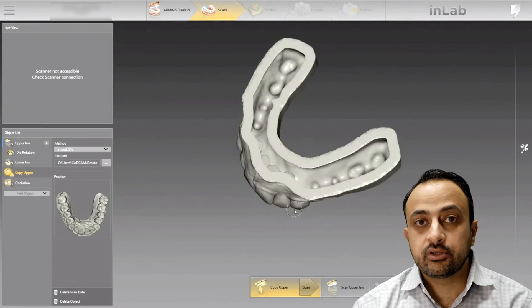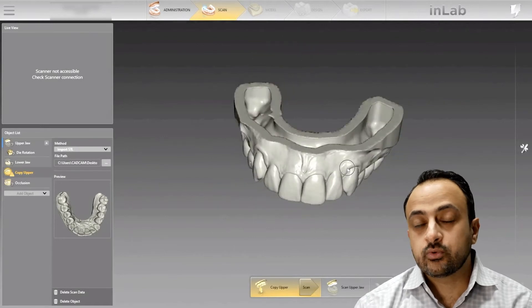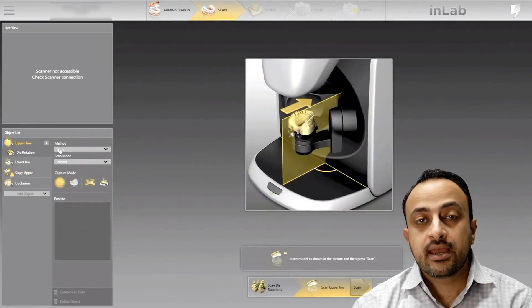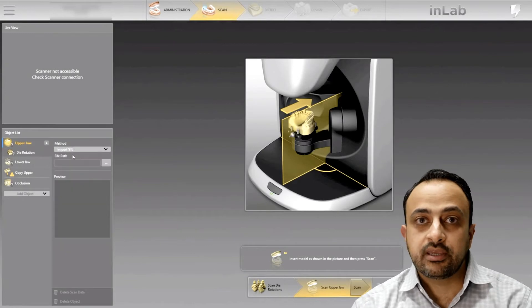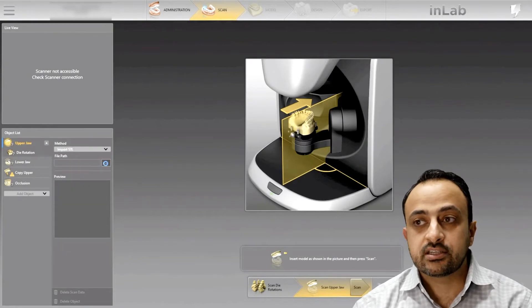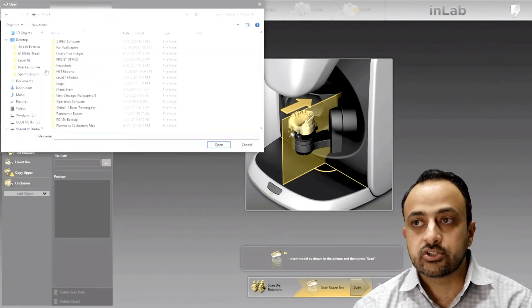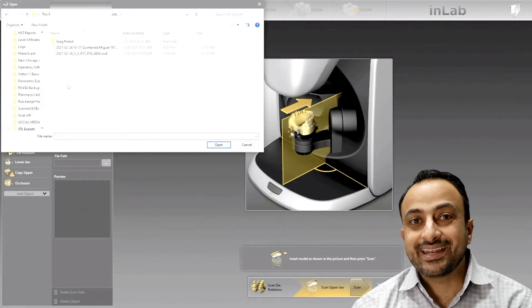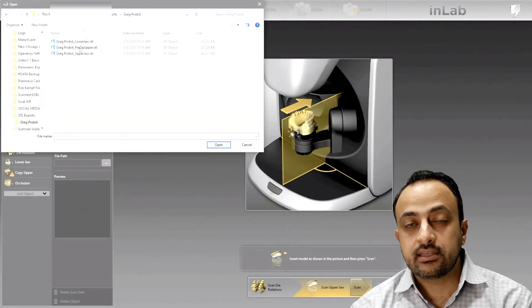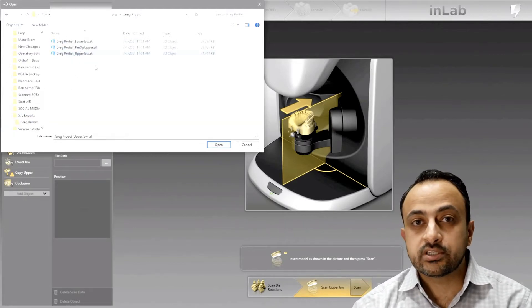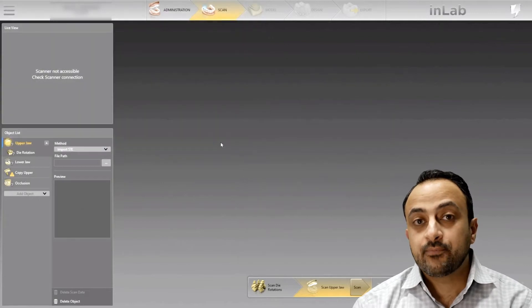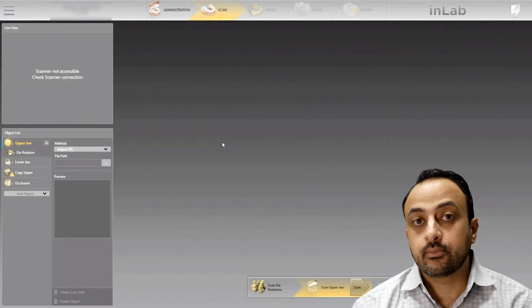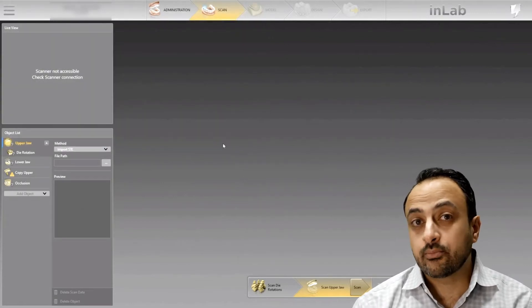Traditionally what we normally do with these cases — with an anterior case — I would 3D print my wax up, I would scan it as a bio copy in the Chairside software and then stitch it with my preparations. The benefit we have in the InLab software is I can import an actual STL, so the full resolution STL of the wax up, and then here you can see I'm importing the STL of the preparations.